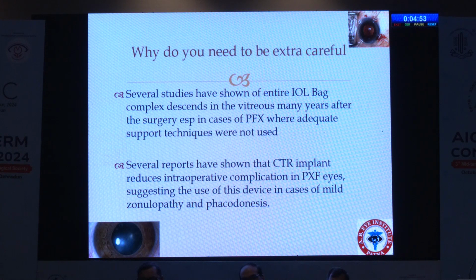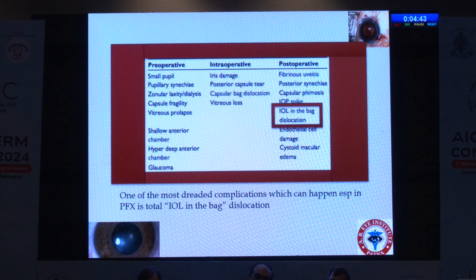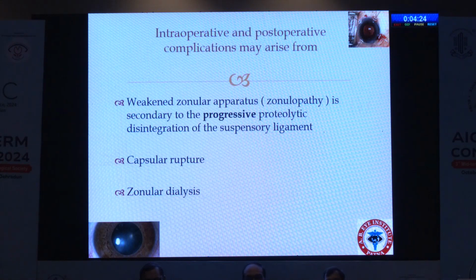Several reports have shown that CTR implant reduces the intraoperative complications of pseudoexfoliation eyes, suggesting the use of the device in cases of mild zonulopathy and phacodonesis. While in these pseudoexfoliation cases several complications can happen preoperatively, intraoperatively, and postoperatively, we will now focus on IOL in-the-bag dislocation, which is one of the most dreaded complications, especially in pseudoexfoliation.